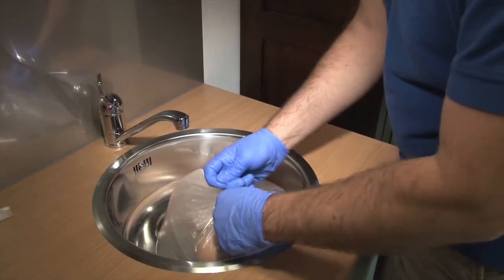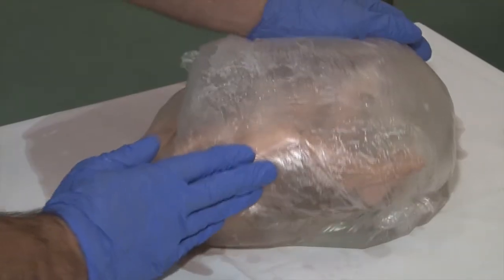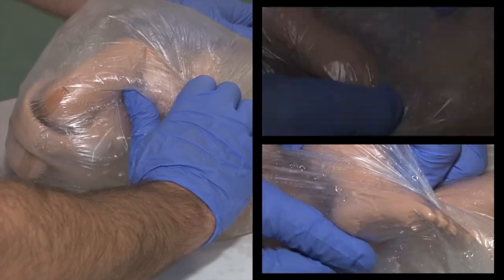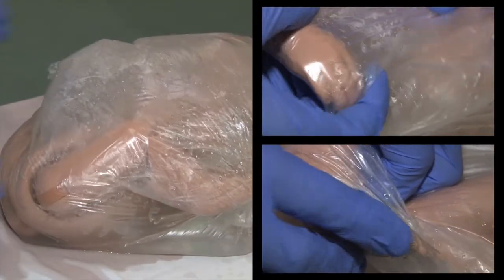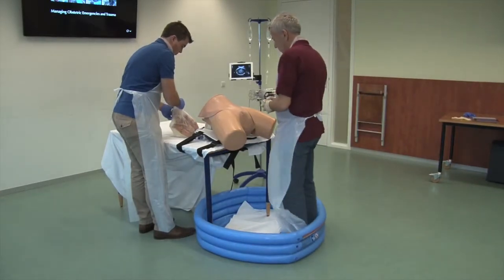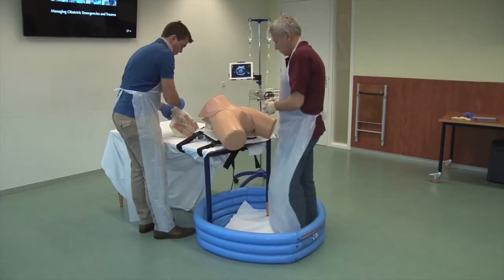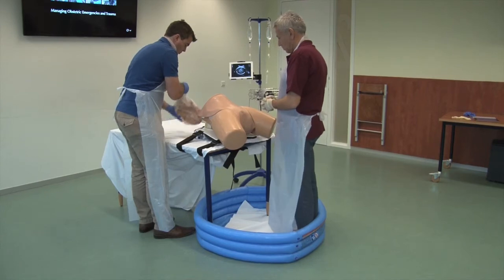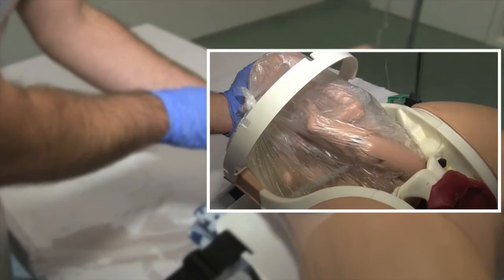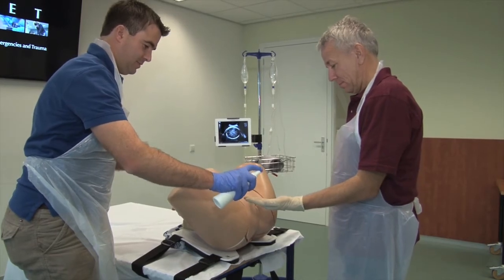The plastic bag is closed. One can demonstrate, before the exercise, how to feel and reach for the fetal feet through intact membranes, how to flex the knee by manipulating it with the finger, and how to recognize feet from hands by palpation through intact membranes. Both instructor and candidate are advised to protect themselves with a waterproof apron. The candidate is advised to remove shoes and socks. The plastic bag with water and fetal manikin are inserted into the pelvic manikin in a breech or transverse position as preferred.